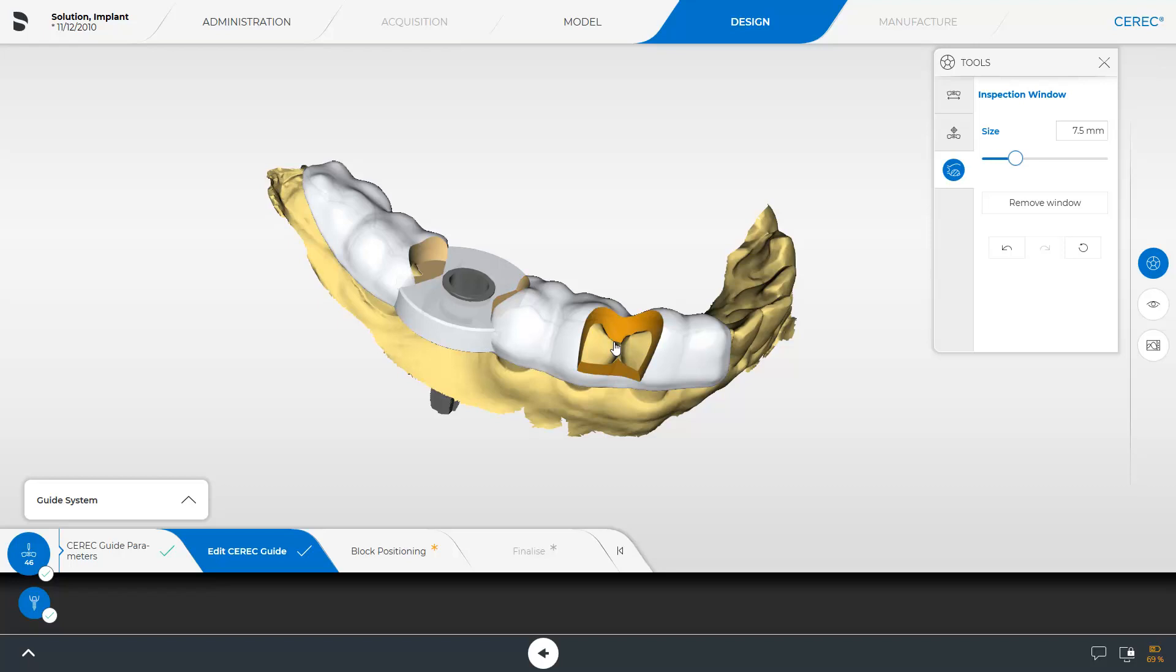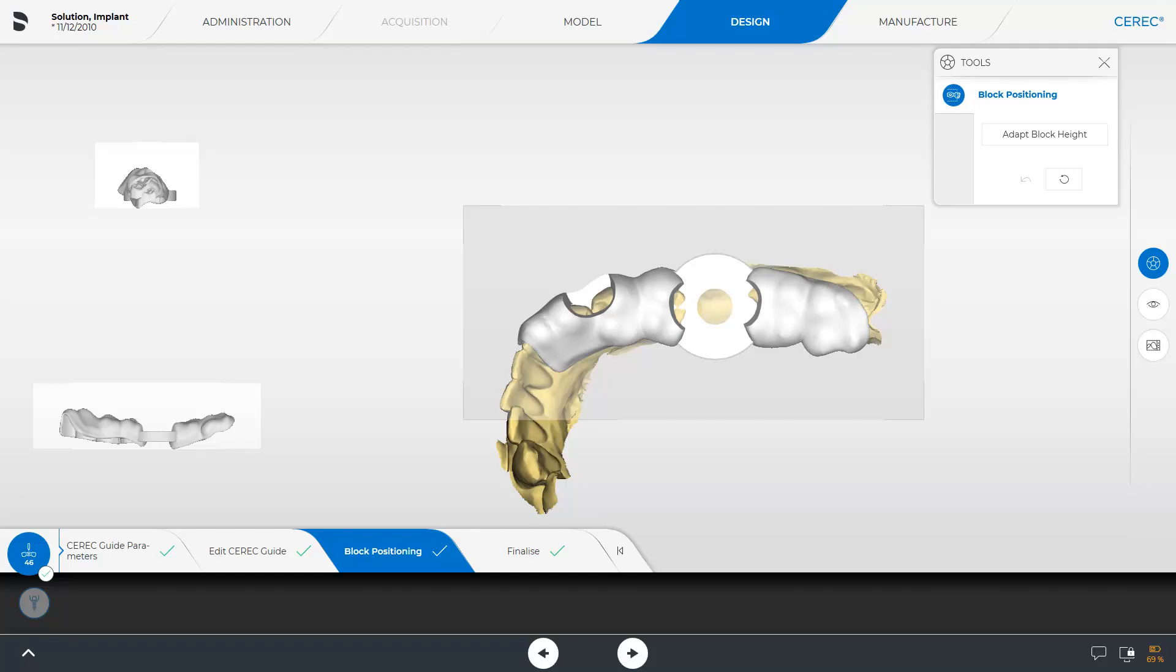Now we move to the next step, Block Positioning. In this step, the surgical guide can be moved in the block in all three views. Areas marked in red are outside the block and are therefore not manufactured.